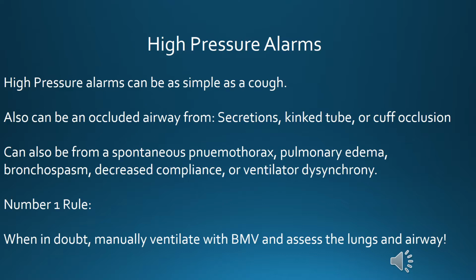Also, the patient could develop a spontaneous pneumothorax, pulmonary edema, go into bronchospasm, any decrease in compliance of the lungs, or any ventilator dysynchrony. If they're bucking the ventilator, as we call it, you'll get high pressure alarms fairly often.